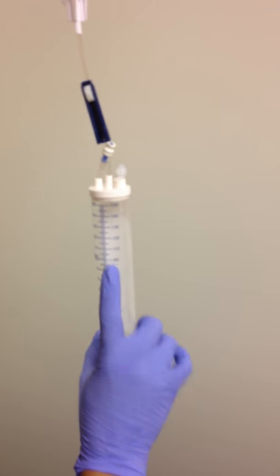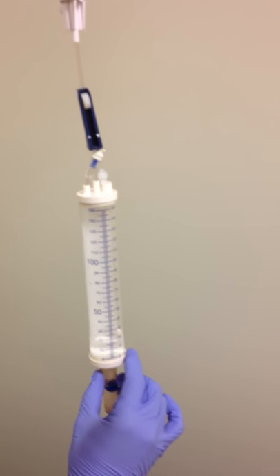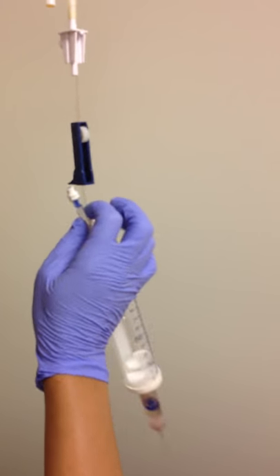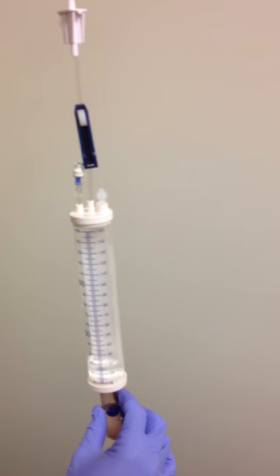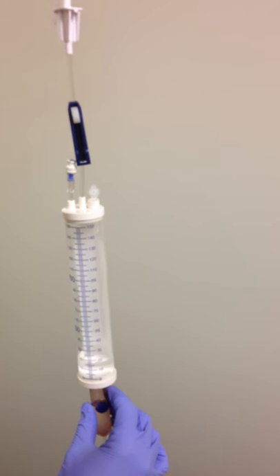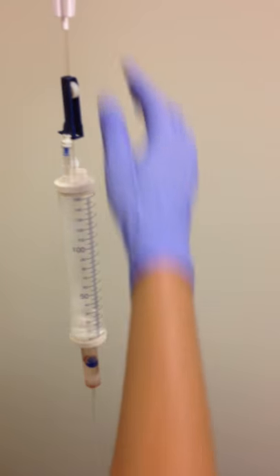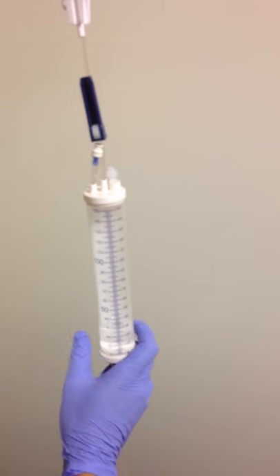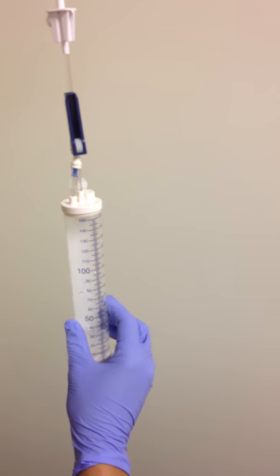Now we'll need to put 100 milliliters into the metered chamber to give our amiodarone. Our amiodarone is going to be dosed 150 milligrams in 100 milliliters of D5W. To get the 100 milliliters, we'll open the thumb wheel between the D5W and the metered dose chamber.